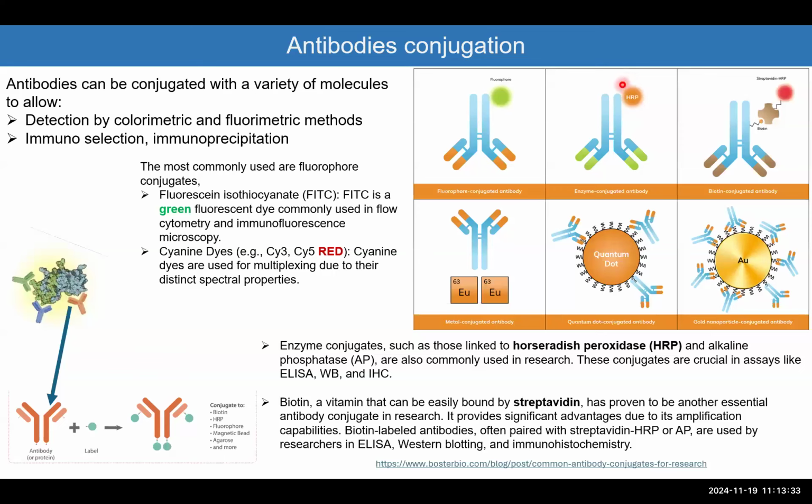The more the substrate is converted from colorless into blue probably, the more blue is generated, which is an indication that this antibody is binding to that protein.